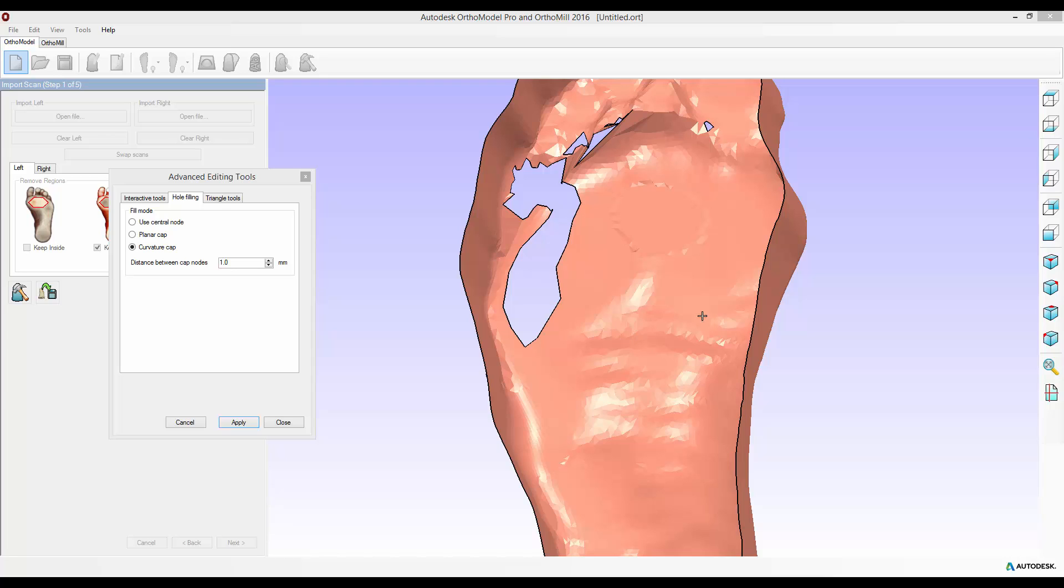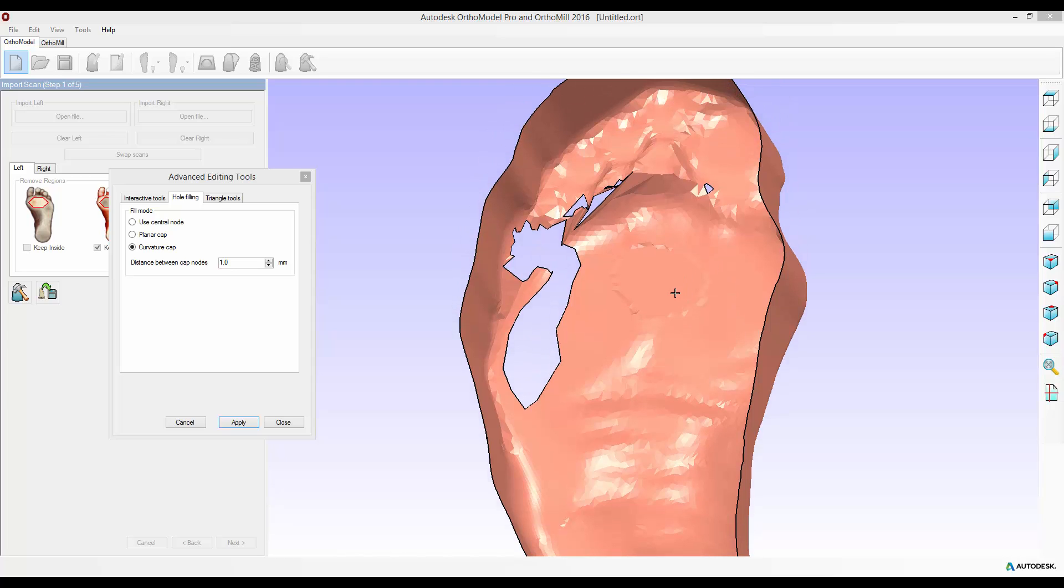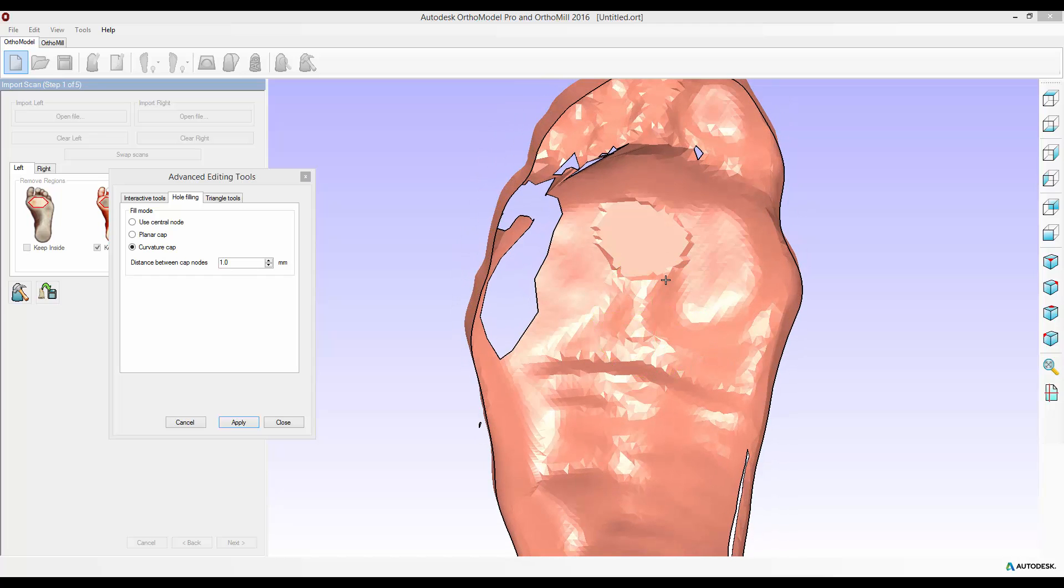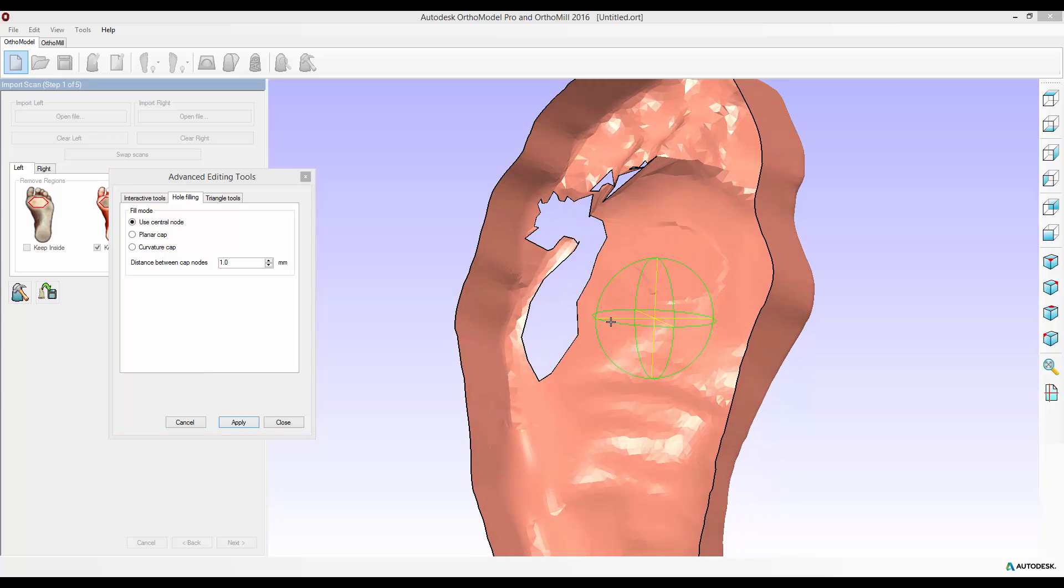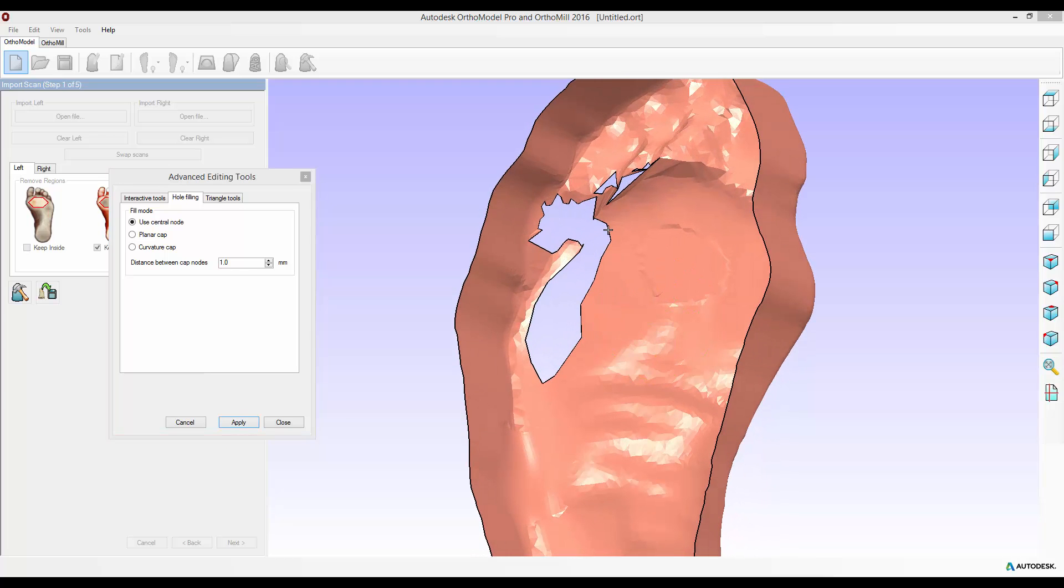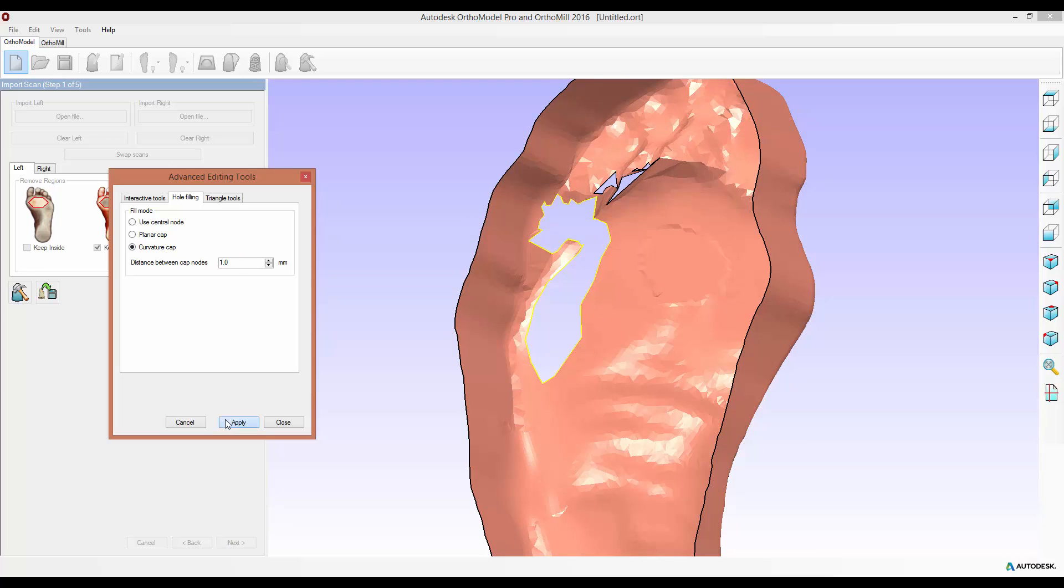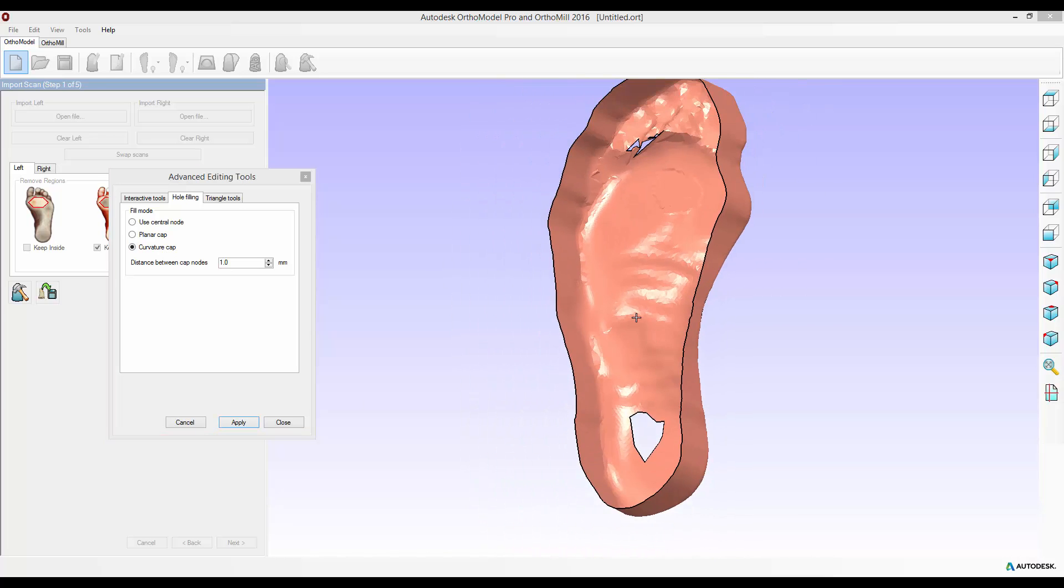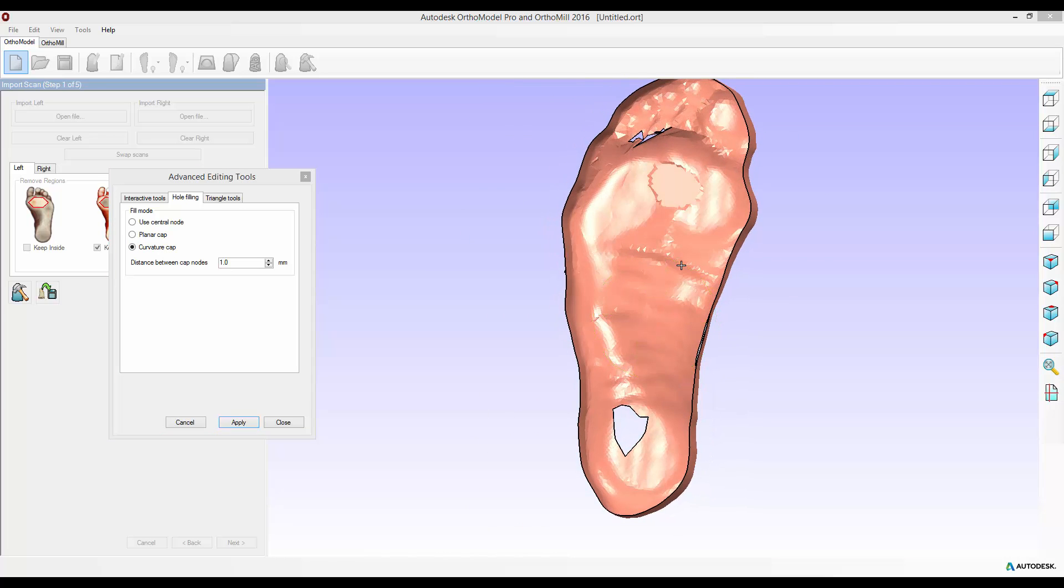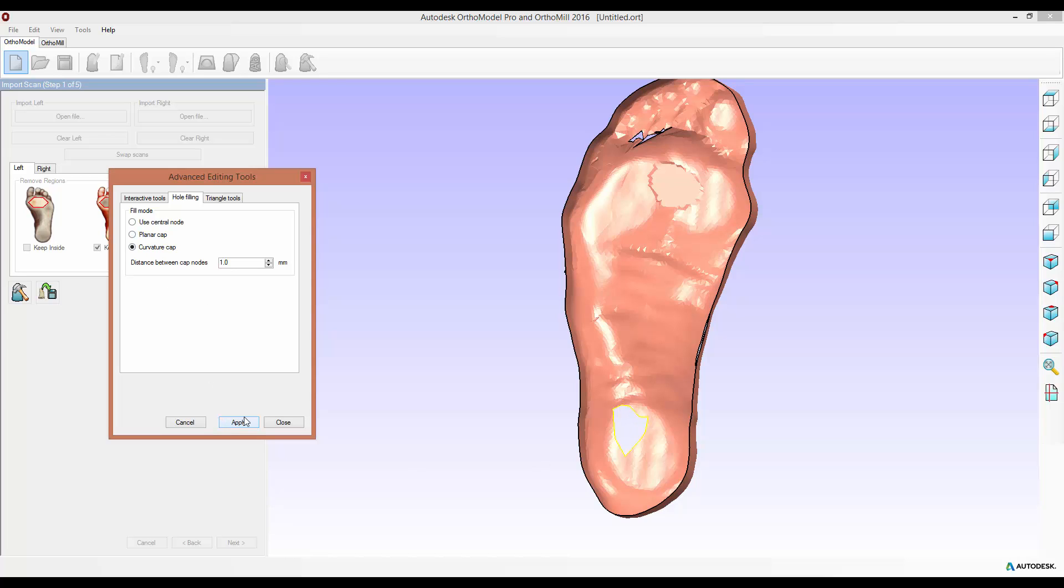You can use your own common sense as which ones to use in which situations. Something small like this I'd probably use a central node or a planar cap, whereas something like this one probably a curvature cap would be best. You can continue using these tools until you've completely edited your scan the way you want. Again for this hole in the heel probably a planar cap or a curvature cap would suffice.